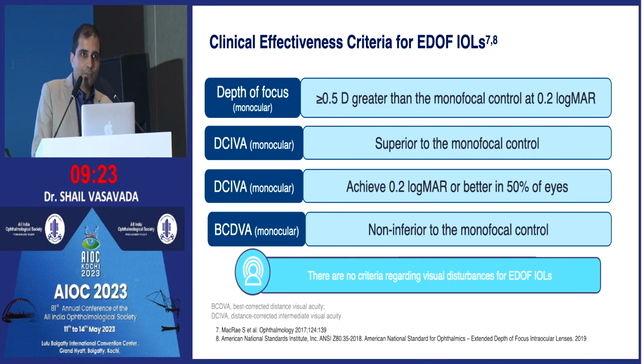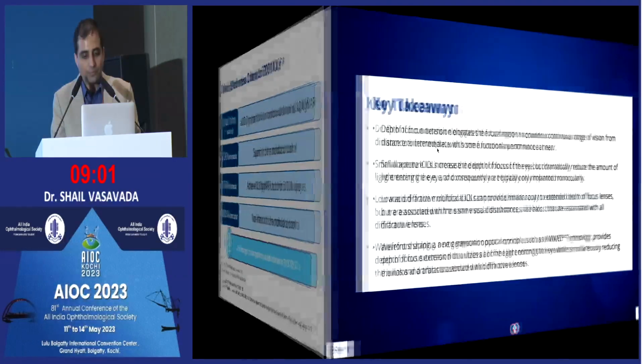So what actually is an extended depth of focus IOL? This is what the FDA approves and categorizes as an EDOF IOL. Any IOL which gives more than half a diopter improved range compared to a monofocal control IOL is considered to be an extended depth of focus IOL.